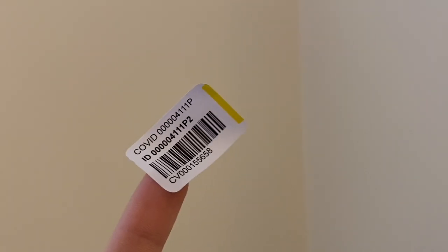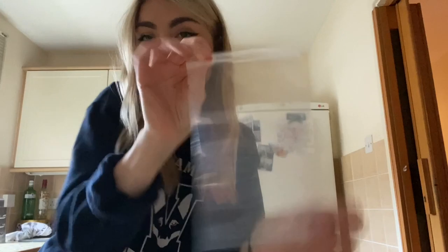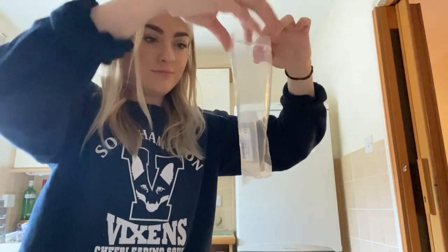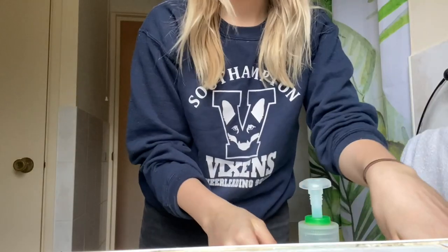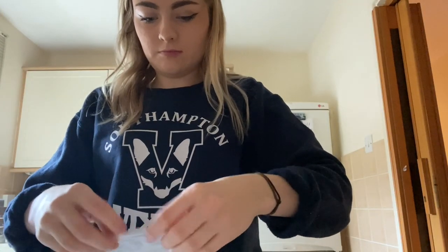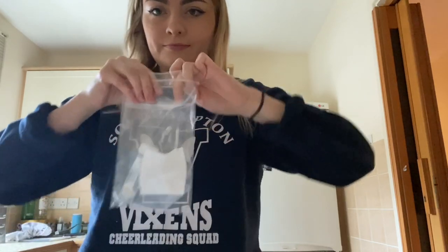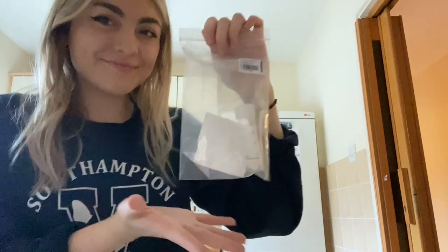Then take one of your yellow sample pot labels and stick it lengthways on your sample pot. Seal the sample pot in a plastic bag with one of the pieces of absorbent material — don't wrap the absorbent material around the pot. Wash your hands again and wash the teaspoon you've just used. Make sure your hands are dry, then put the bag containing the pot into a second bag with as little air inside as possible. Stick one of the blue outer bag labels on the outside of the bag, and this is your completed test.